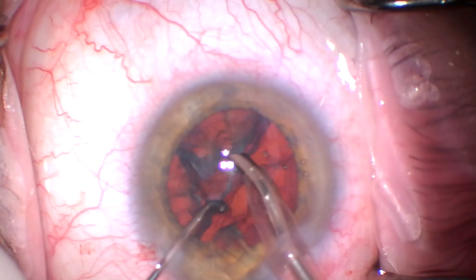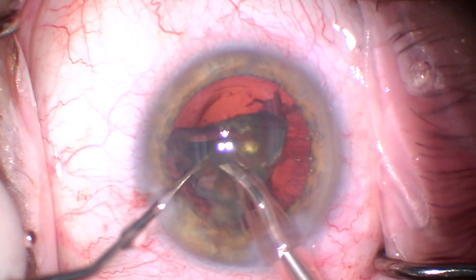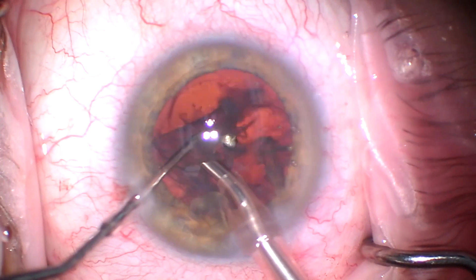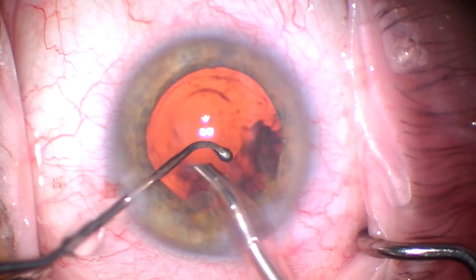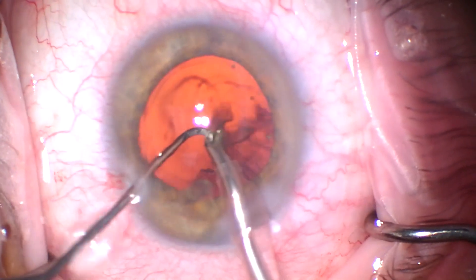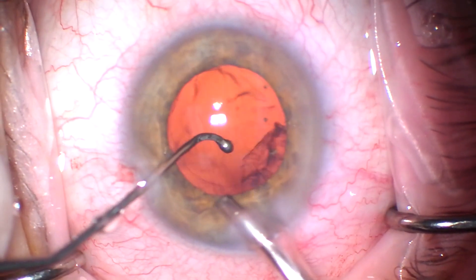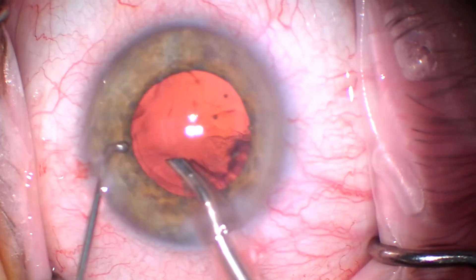Slightly awkward on this last hemisphere, but then we drop it and emulsify the last little bit here. There are a few little chips remaining, kind of sub-incisional, that we'll get — it's arguably safer to go after those with the I&A tip, but sometimes if it's very dense it's hard to get it to go through the I&A tip.